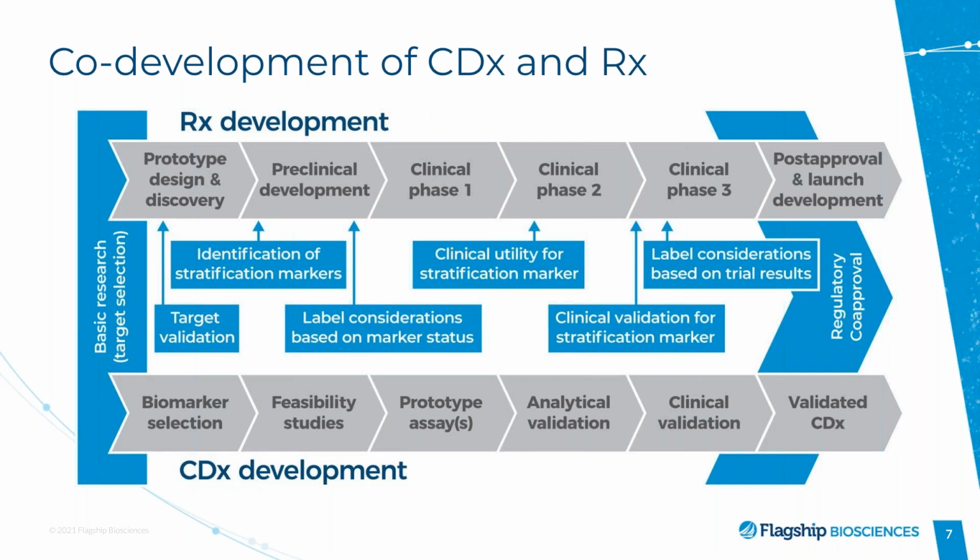So once we established this hypothesis, the next step was to determine what assay we were going to use to measure DKK1 levels. And in our case, we tried IHC for protein, couldn't get that to work, and then moved on to this RNAscope assay to measure DKK1 mRNA levels. And what I'd say at this point, you want an assay that's going to be reliable, but it doesn't have to be validated, verified extensively. Like I said, you do want to believe in it, but to really take it to that next level, which I'll touch upon later, such as a laboratory developed test, that's much more a financial commitment.